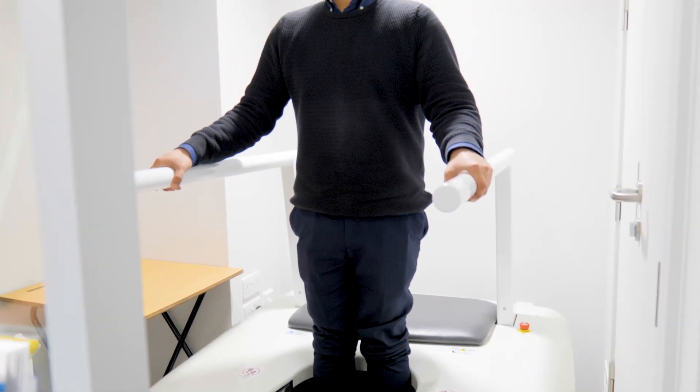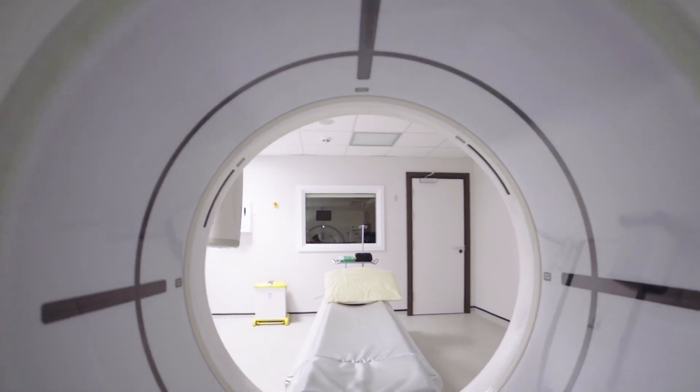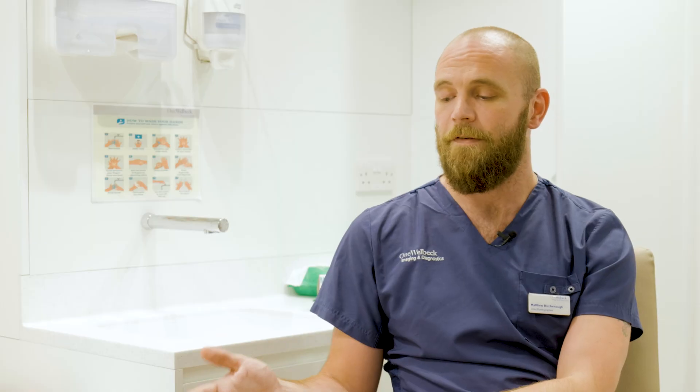A standing CT scan differs from a conventional CT scan — first of all, the patient is standing. The patient stands up on the platform and the CT scanner rotates around their feet and ankles, as opposed to a conventional scanner where the patient lies down and goes feet first into the scanner. The obvious difference is the weight-bearing. The less obvious difference is that in conventional CT we have a broad beam of x-rays that takes a lot of information at once through the patient.